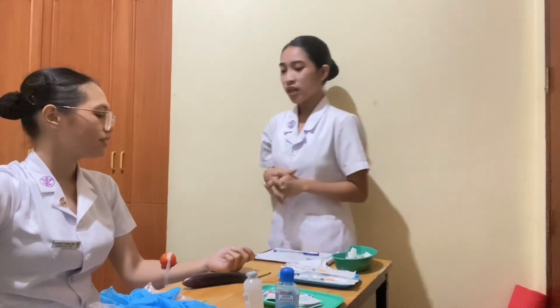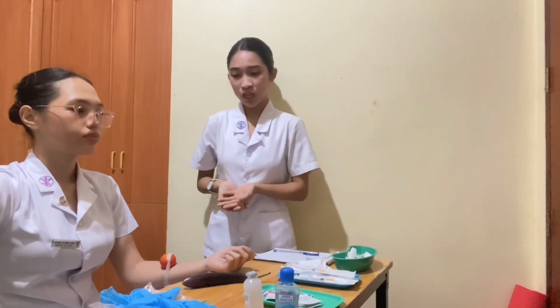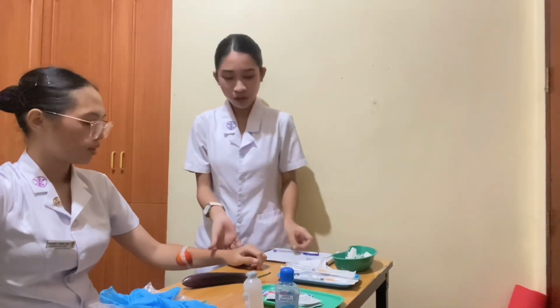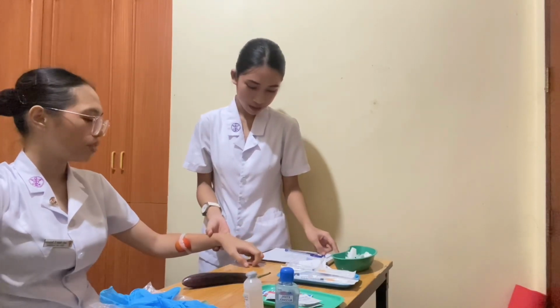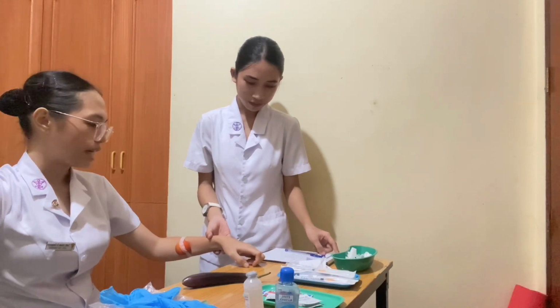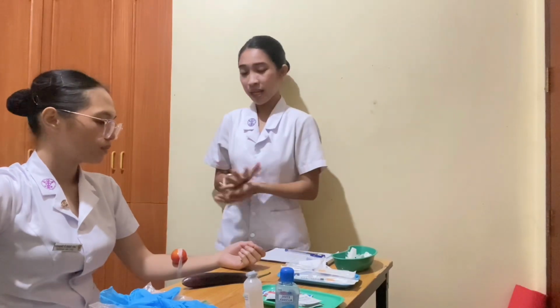Morning. Okay, so for today, I'm going to do an intradermal injection to you. Ma'am, may I see your wristband? And can you please state your full name and date of birth? Lady Isaiah Viparine. Date of birth is October 1, 2004. Age is 19. Okay. So for today, ma'am, I'm going to do an intradermal injection.